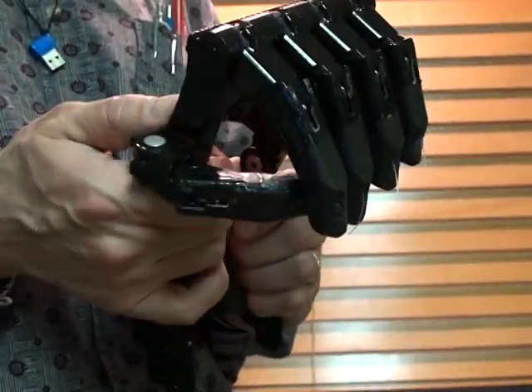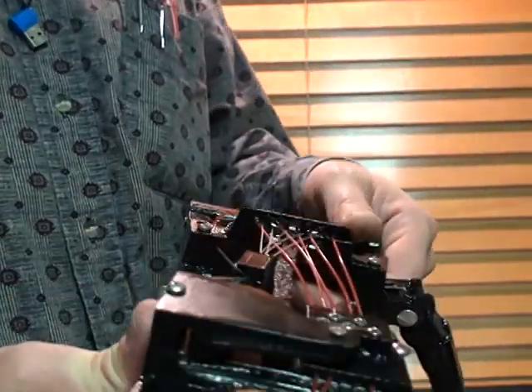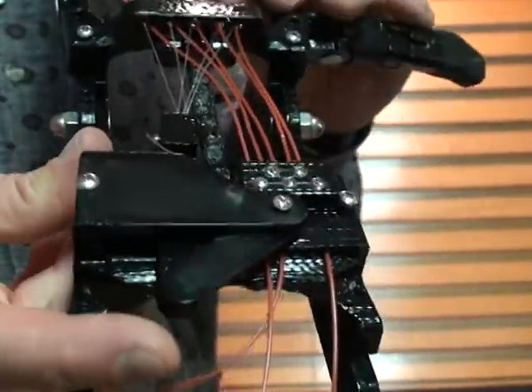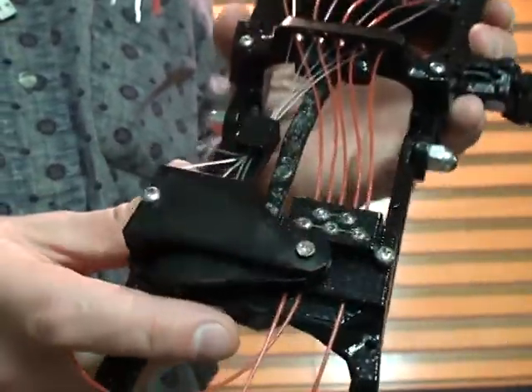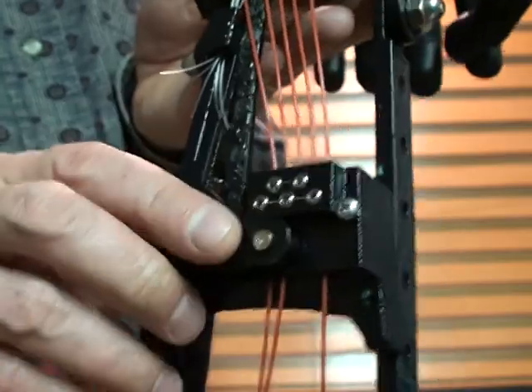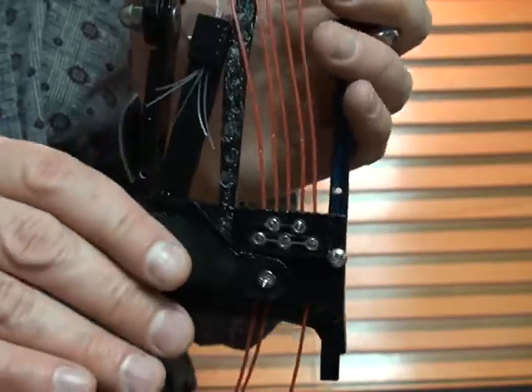I just need to give this mechanism a little bit more range so that this can close all the way. It's not closing all the way, and that's because of the little pivot, you can see the pivot sticking out here. The pivot's attached at 3 points. It's not going quite long enough. Okay, this little pivot piece catches on the flexor cable block, so that's sort of what stops it. So I can definitely fix that.